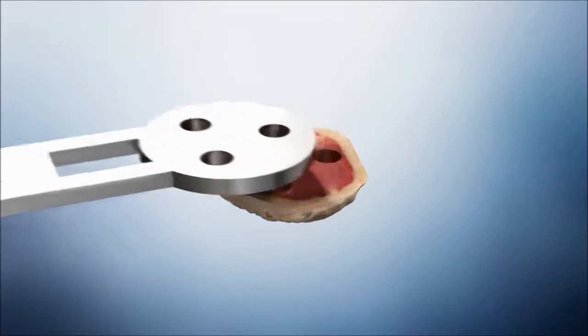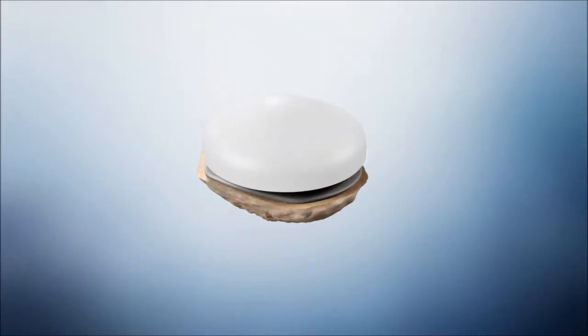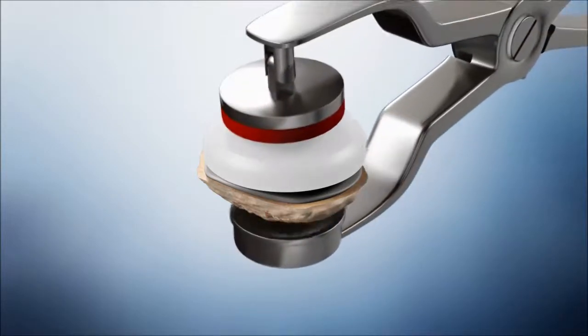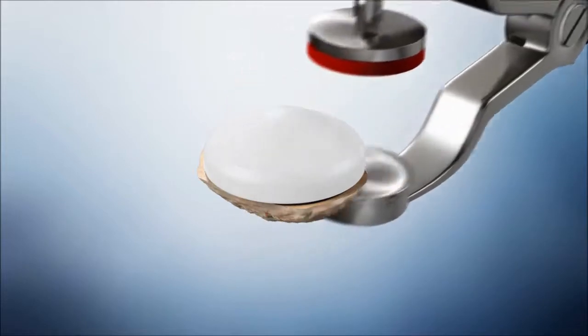Enlist the proper cleansing and cementation technique. Apply cement to the prepared patellar bone. Introduce the patellar implant to the prepared bone and utilize the patellar clamp to stabilize the implant while cement is curing.